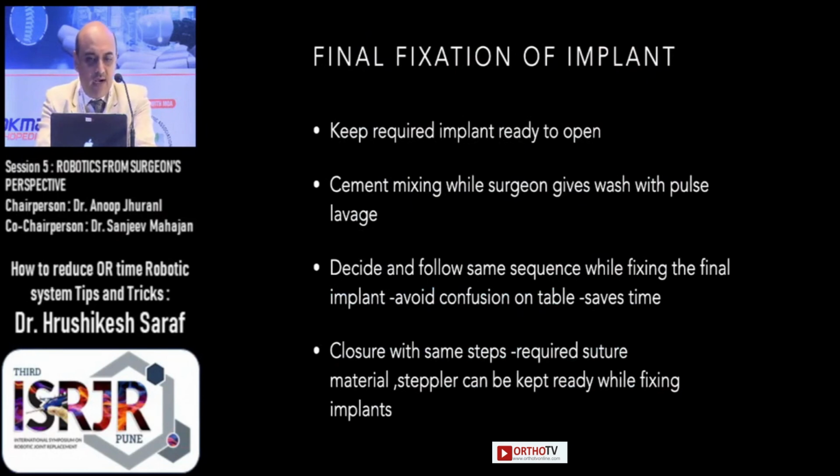Keep the required implant ready to open, cement mixing while the surgeon gives a wash with pulse lavage. Decide and follow the same sequence while fixing the final implants. That means if I am doing a PS knee, I always fix tibia first, then femur, and then I put the insert. If I am doing a CR knee, I fix the tibia, I put the insert, and then I fix the femur. So if your scrub nurse knows, if your implant person knows, they will give the same implant in your hand and you will save your time.